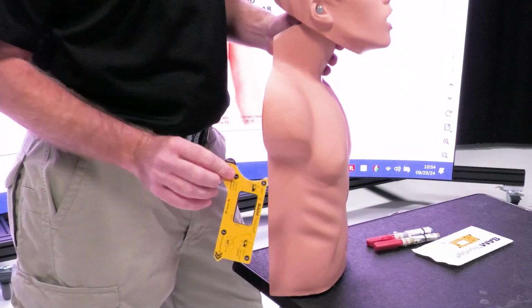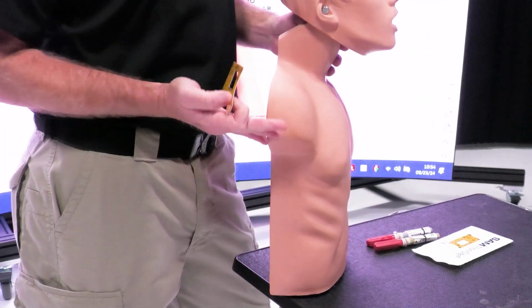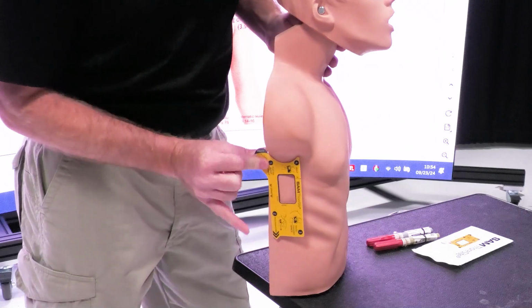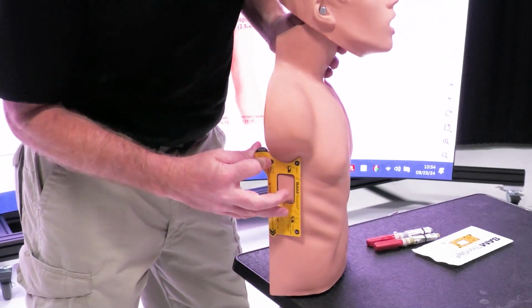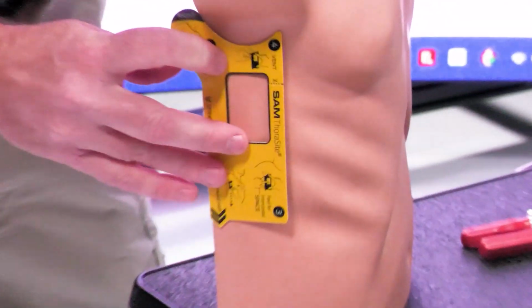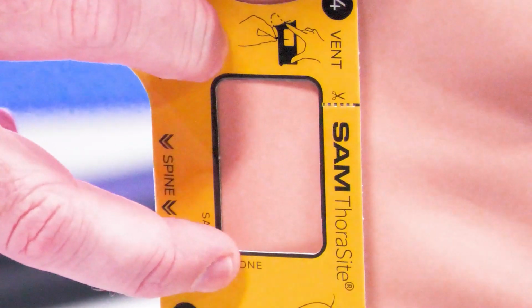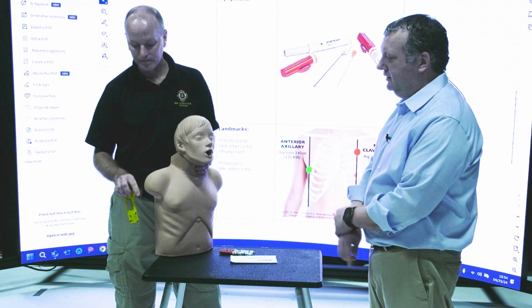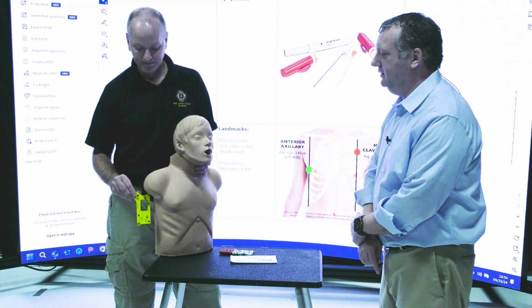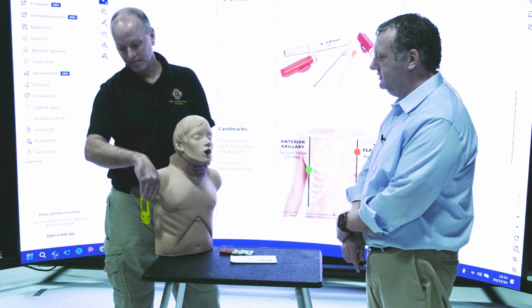But the device is very, very simple. Patient's right shoulder, arm's going to be out at 90 degrees, because if you raise the arm up, then the armpit will actually change spots. But at 90 degrees, you put it in, align it with the hip, and then there is your site. These cards can go on both the left and right side. You can flip them over. As long as you remember that the writing is the correct way, that you can read it and it's not upside down, then you will have it in the correct position.